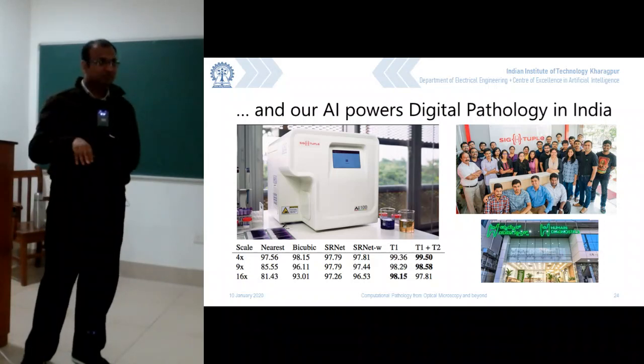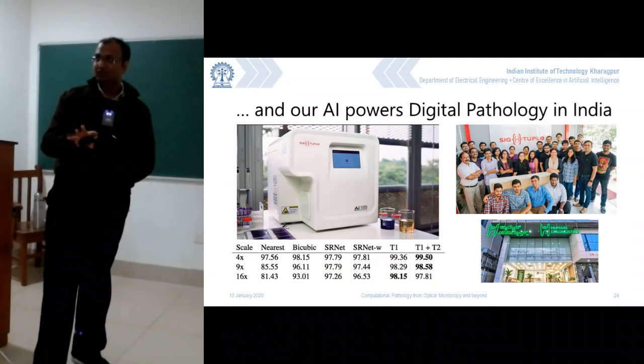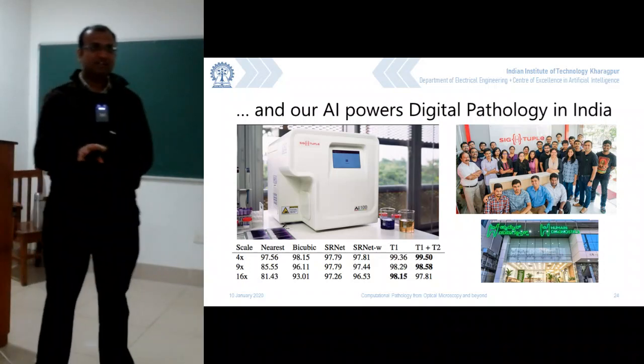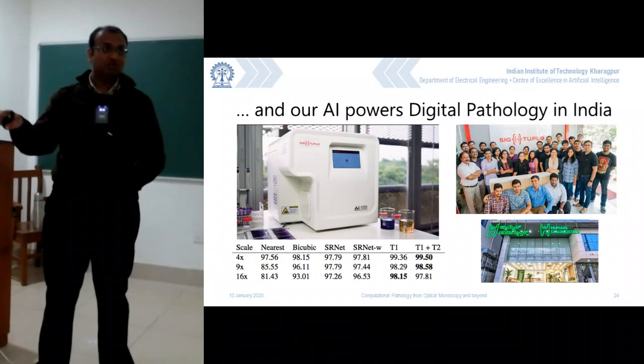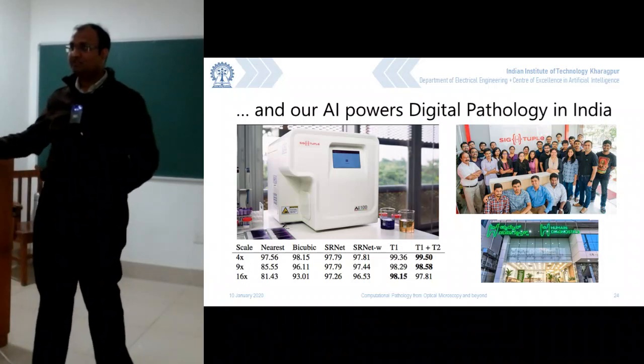So if the super resolution one matches very close, say here it's 99.5, so there was a 0.5 drift. 0.5% of the time we could not detect it, but the majority of the time, 99.5% is a very high concurrence. From a super resolved image also it found the same amount of pathological points which you could find in an original full resolution image itself.